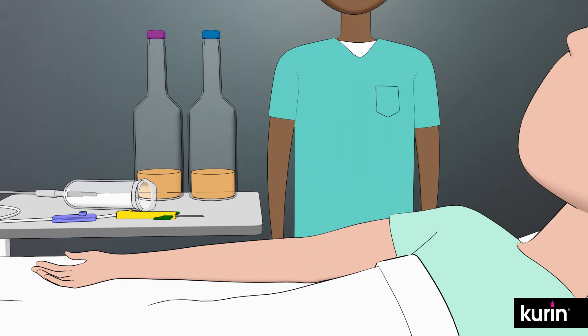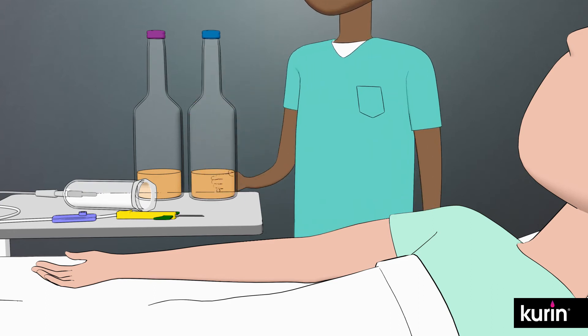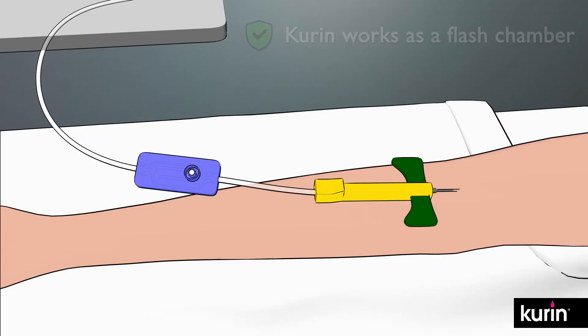To use Curin, first prep the insertion site and disinfect blood collection bottles per hospital policy. Following your hospital protocol of aseptic technique procedures, access your patient's vein with the butterfly needle. Curin works as a flash chamber so you know you're in the patient's vein when you see blood flow into the U-shaped side channel.